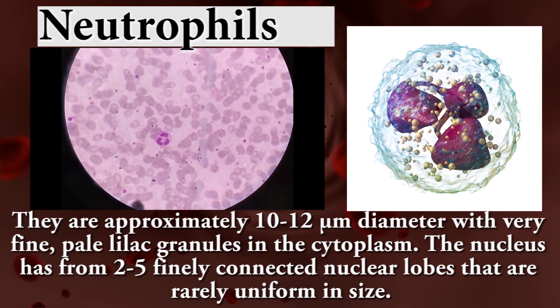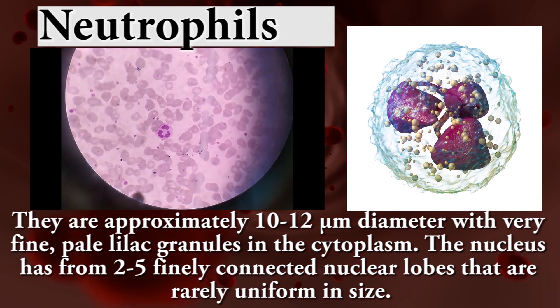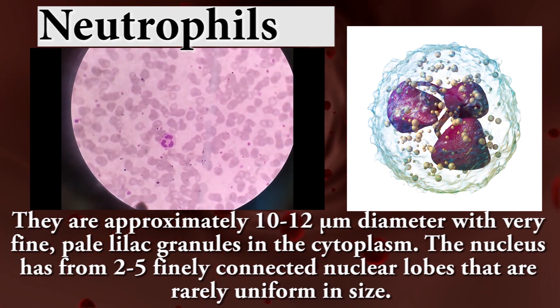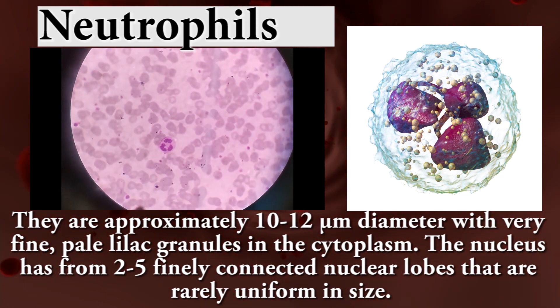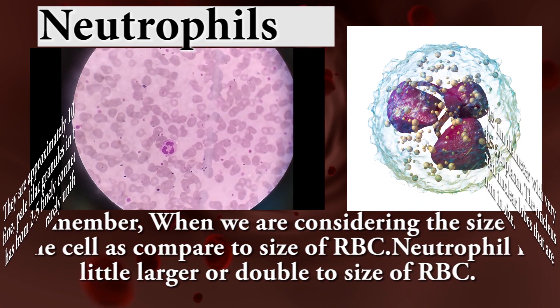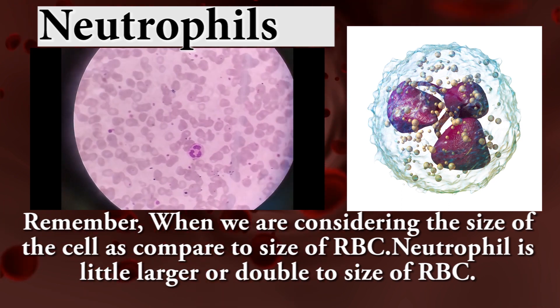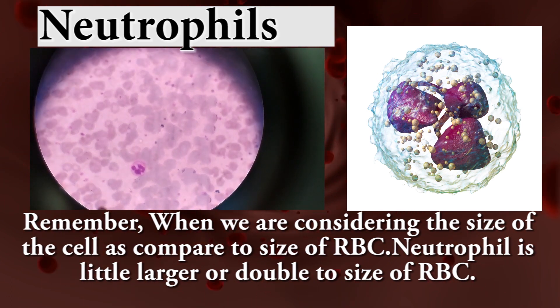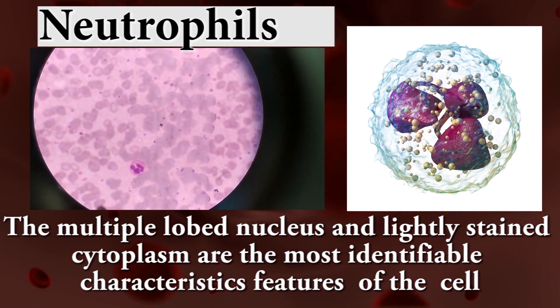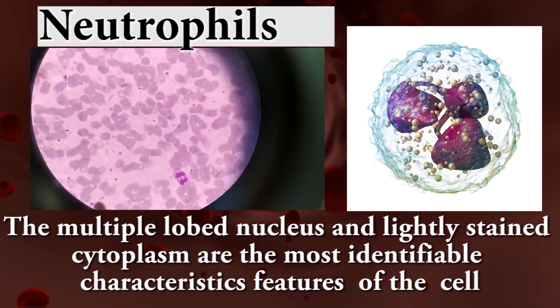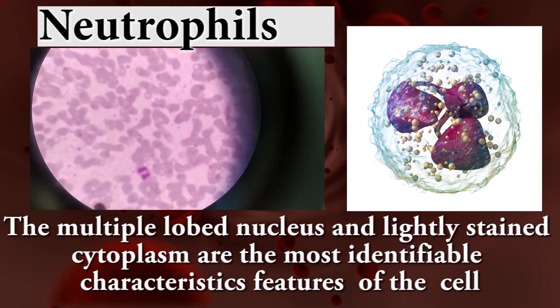Neutrophils are approximately 10 to 12 micrometers in diameter with very fine pale lilac granules in the cytoplasm. The nucleus has 2 to 5 finely connected nuclear lobes that are uniform in size. Neutrophils are little larger or double the size of RBCs. The multiple lobe nucleus and lightly stained cytoplasm are the most identifiable characteristic features.